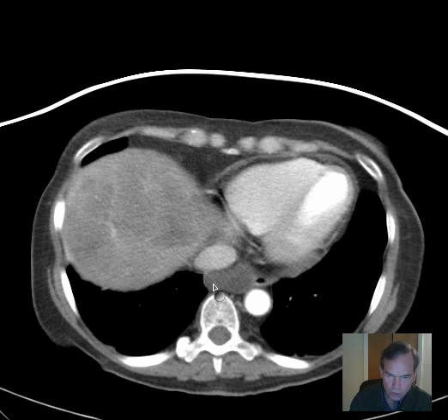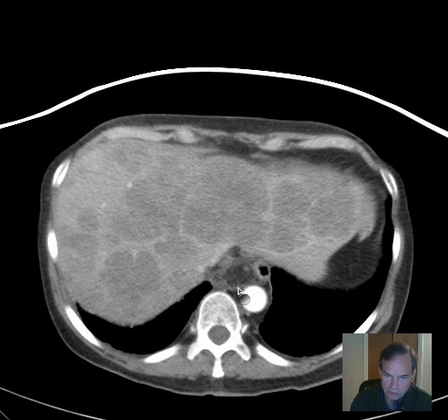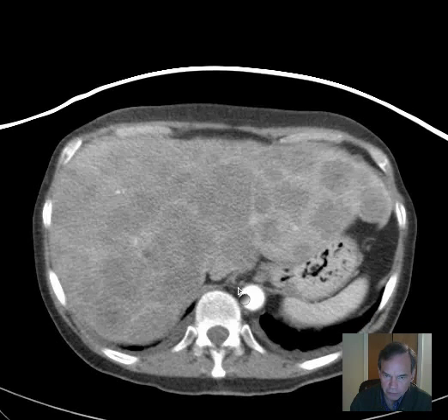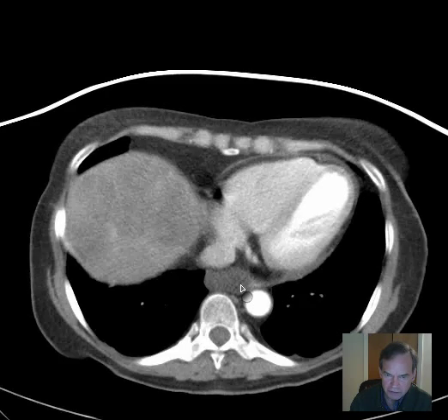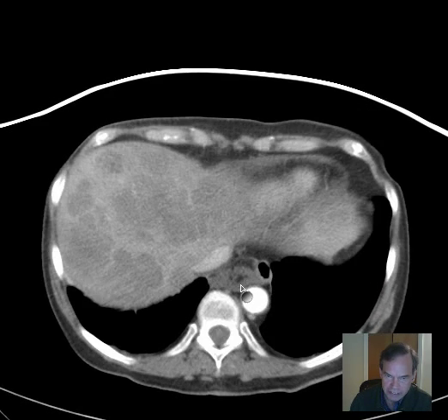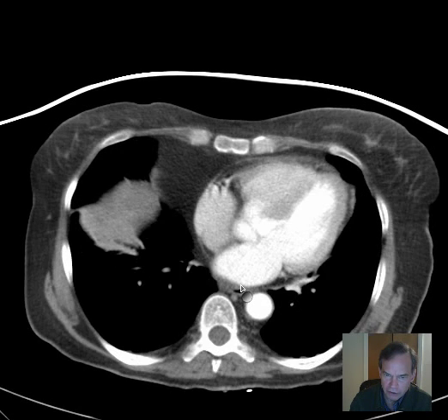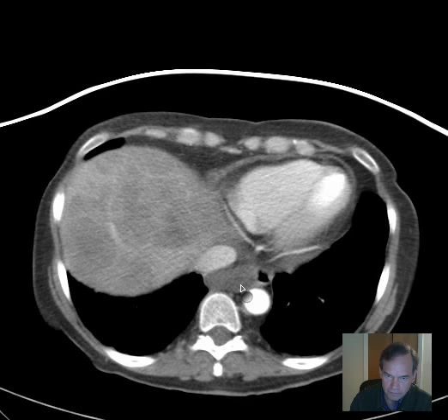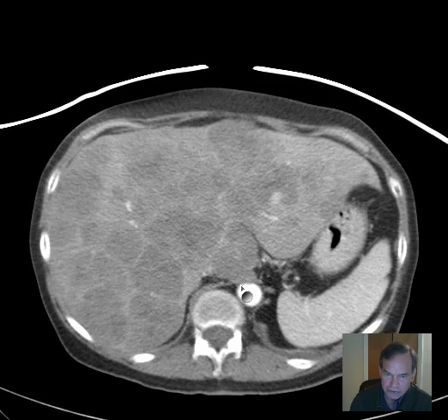It doesn't look like it's a normal anatomic structure. It doesn't seem to have the low attenuation configuration of a cyst of some sort. So I think that this is a neoplasm. It's very likely arising from the esophagus. There's really nothing else here that it would likely arise from. We don't usually see masses like this arising from the diaphragm.